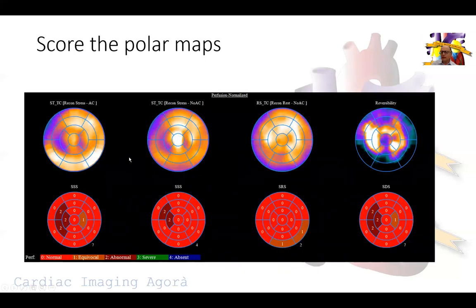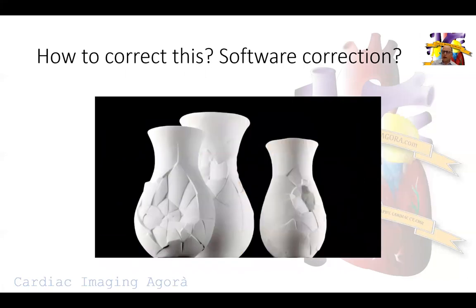Trying to read the study you can read it this way, but none of us would be comfortable reading the study in this fashion, given that it doesn't make sense from an anatomical standpoint and the fact that we saw motion artifact on the raw images. So is this a motion artifact, and how do we correct for it?